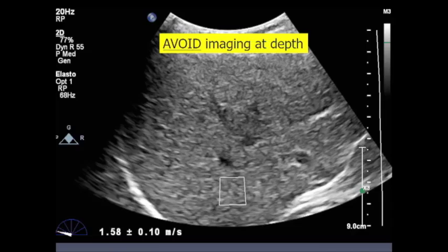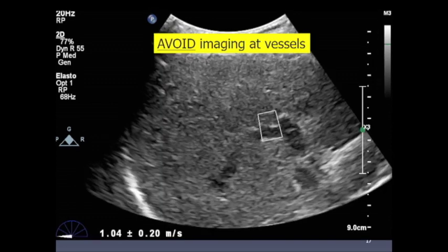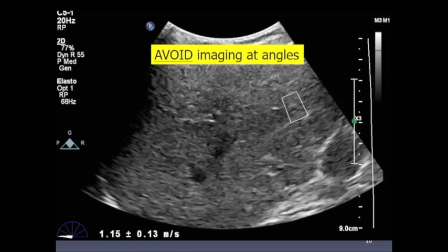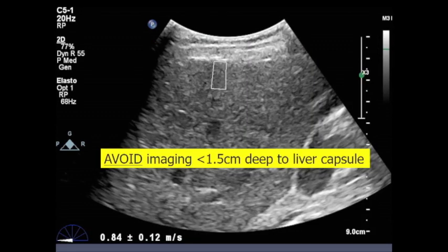Avoid imaging at depth: the ARFI pulse, like every other ultrasound beam, is attenuated the deeper you go, increasing error in shear wave amplitude measurements. Avoid imaging at vessels — both in-plane and out-of-plane, so look up and down to confirm no nearby vessel. Avoid imaging at angles, as the ARFI pulse is refracted and less energy is delivered. And avoid the first 1.5 centimeters from the liver capsule due to refractive artifact.